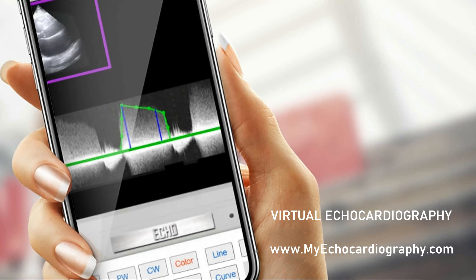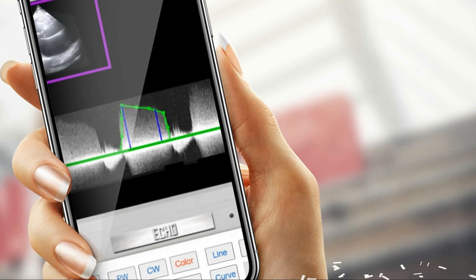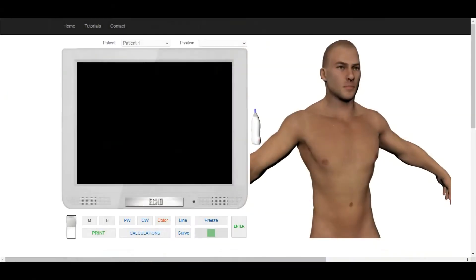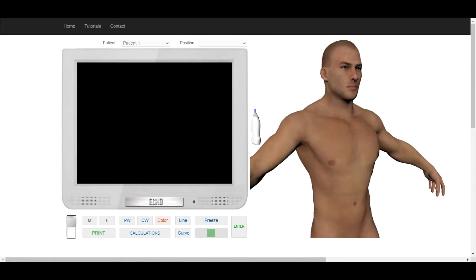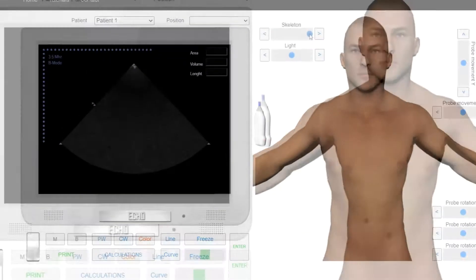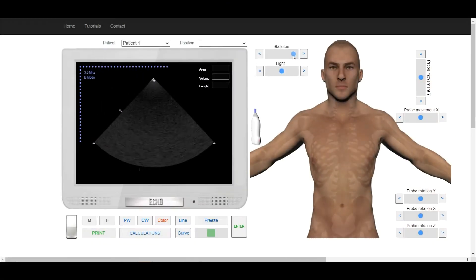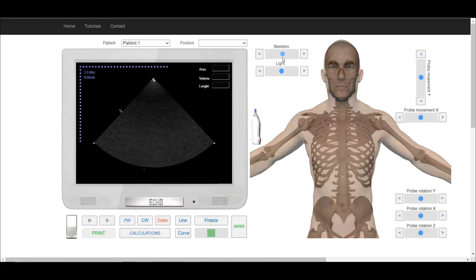Welcome to Echocardiography Online Simulator MyEchocardiography.com. Using the appropriate slider, choose the transparency level.